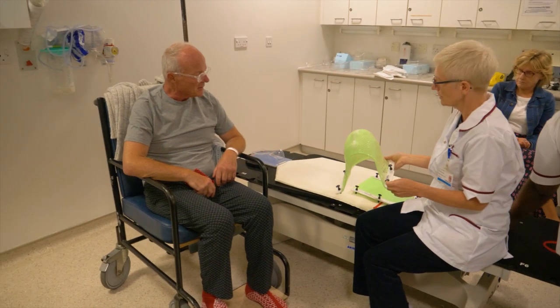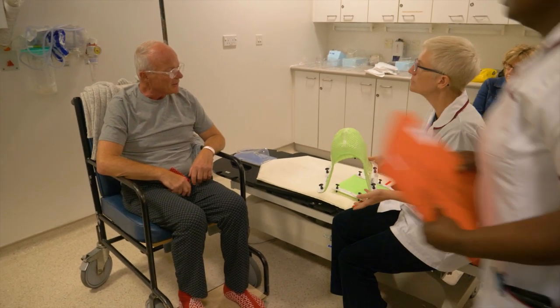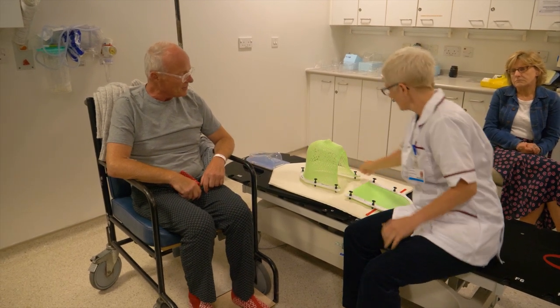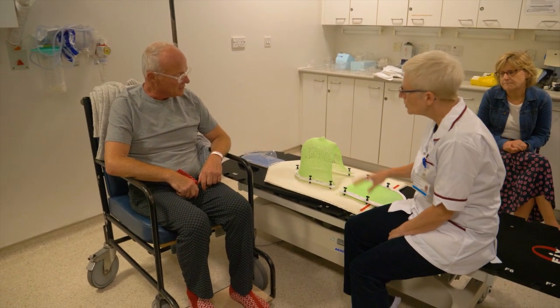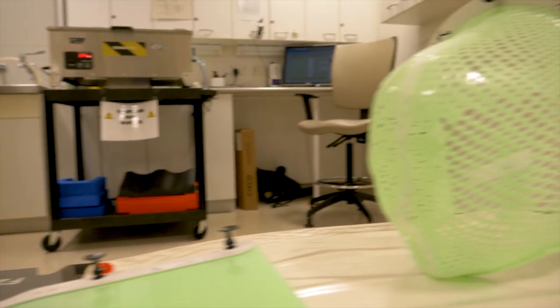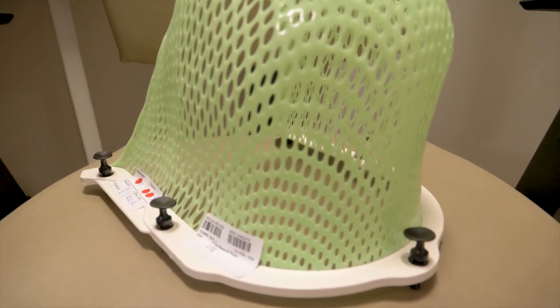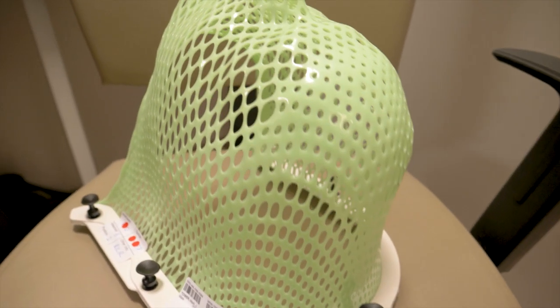It's worth noting that not all patients that receive a diagnosis of some kind of brain cancer will get radiotherapy and/or chemotherapy — it's very diagnosis dependent. If a patient needs to have radiotherapy towards the brain, head or neck area, they usually need to wear a mask, and this is something called a mould, head shell or cast.